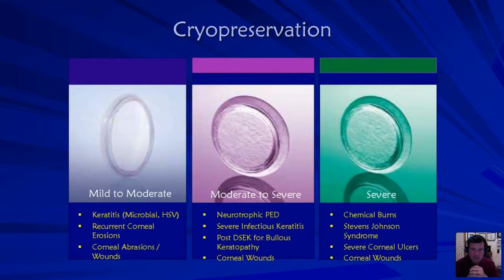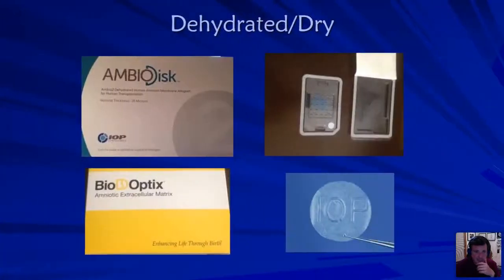You do kind of get a little bit of a bandage contact lens at day 6 or day 7, but really 3 days minimum. Man, if you can get them to 5 days with it on there, which most patients can because they have severe problems, they'll keep that membrane on there because they want it fixed. And like these filamentary keratitis patients, once they see how great their eye feels, they have no problem wearing it for that 5 to 7 days, coming back and doing the other eye, because then they get about 6 to 9 months out of it. So there's a few pearls in there on how to use amniotic membranes.